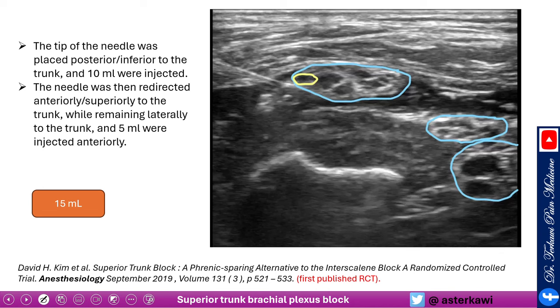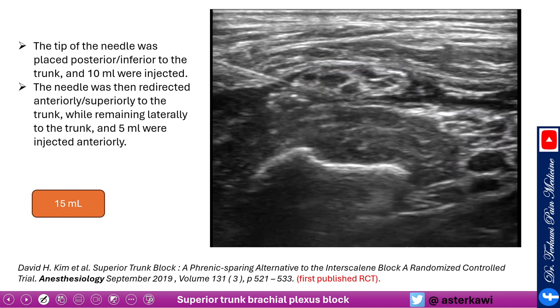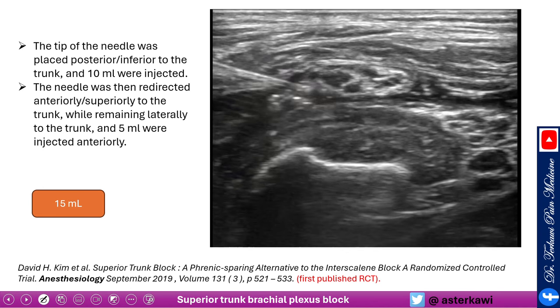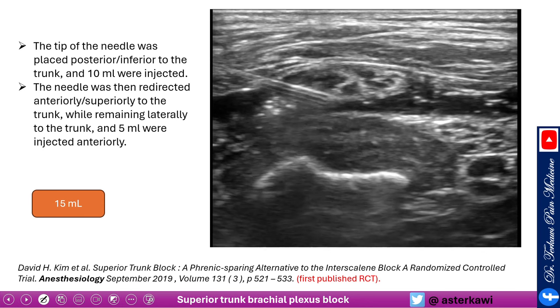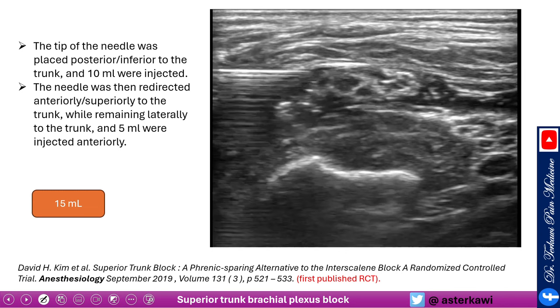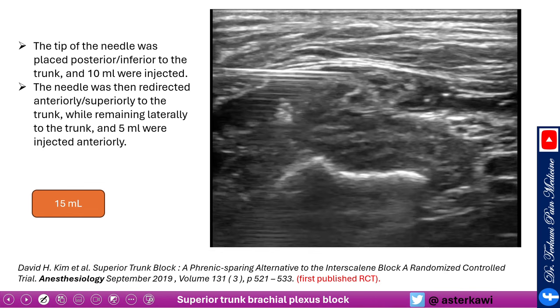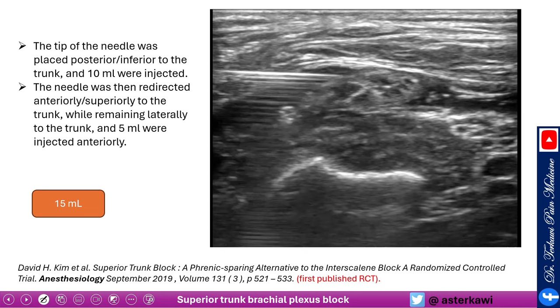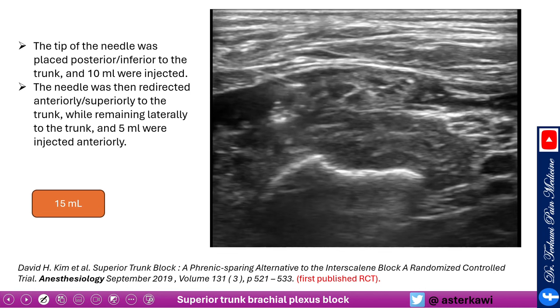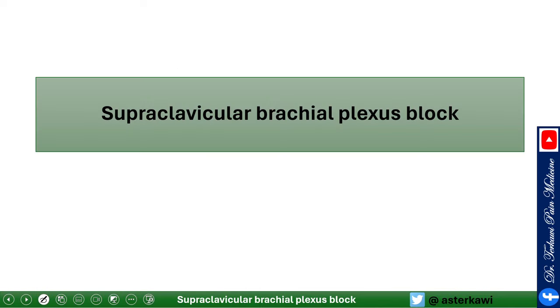This is the technique from the original paper: place the tip posterior and inferior to the trunk, inject about 10 ml, see the nice spread, then withdraw, redirect anterior and superior, and inject 5 ml. Confirm good spread to capture the suprascapular nerve, which is lateral and superficial to the superior trunk.